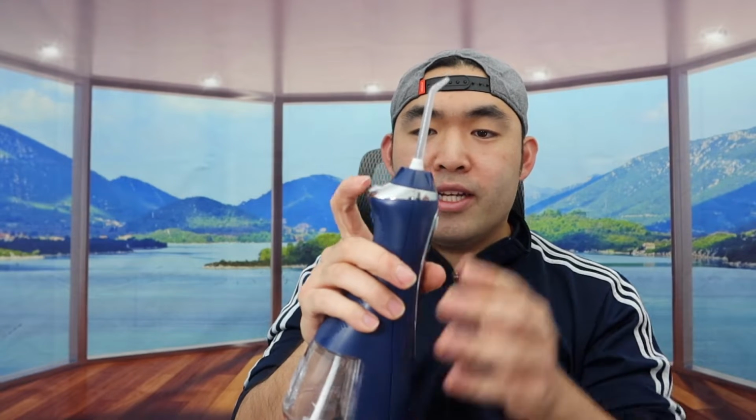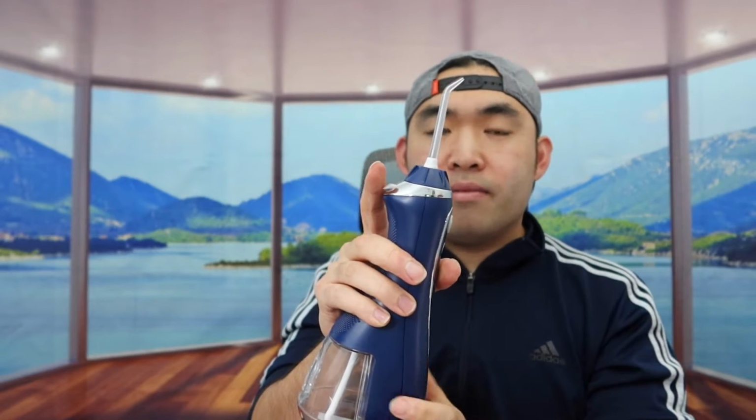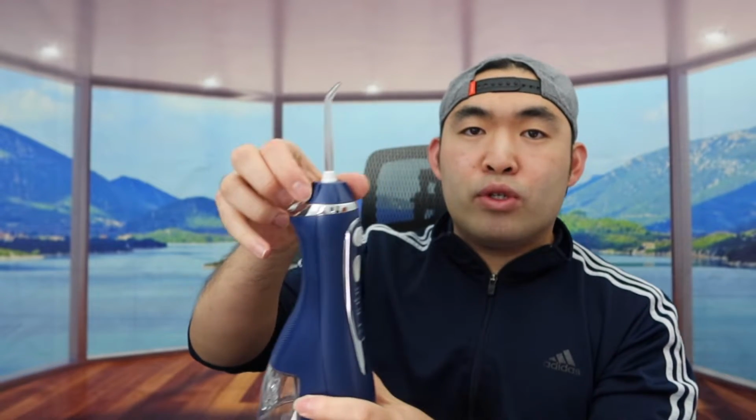But now I'm going to want a tip to show you guys what it looks like, and then we'll test it out. So I'll use a tip, we have 2 of them. If you put it inside this, that basically locks it in. Like I mentioned, if you want to unlock it, you push this button, and that basically unlocks it. If you put it back in again, that locks it in. And like I mentioned for the top right here, if you twist it, that allows you to turn it 360 if you want to.